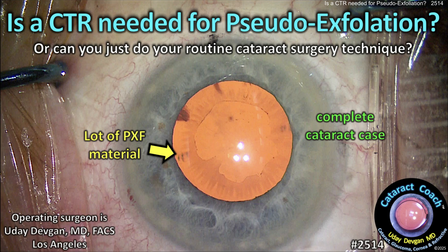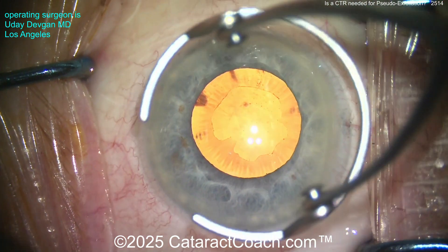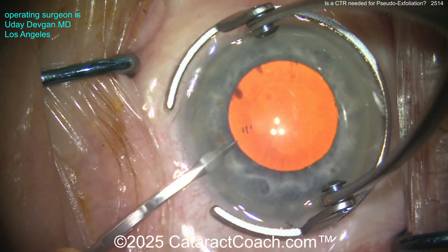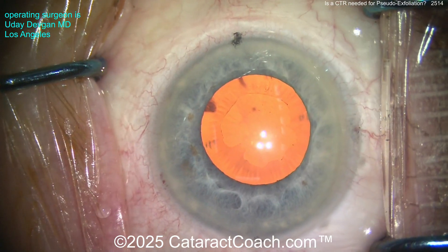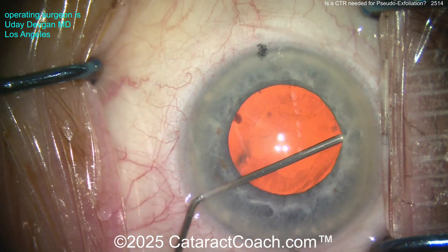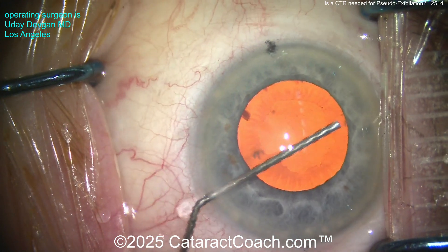cataractcoach.com: Is a CTR needed for pseudo-exfoliation, or can you just do your routine cataract surgery technique? This is a complete cataract case — going to show you start to finish. Starting off with a good paracentesis, good draping, toric marks on the cornea for the steep meridian, and look at all that pseudo-exfoliation material. This is the maximum pharmacologic dilation achievable.